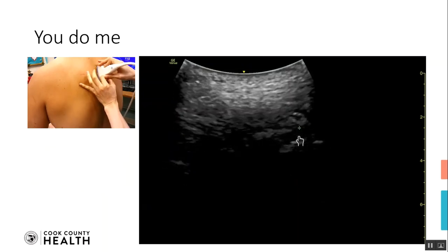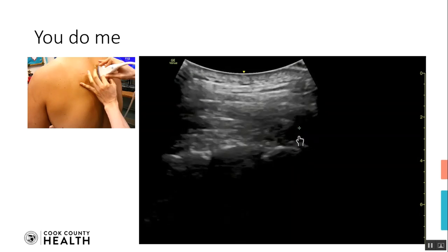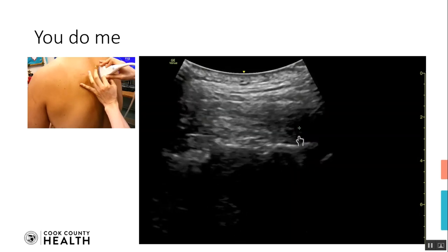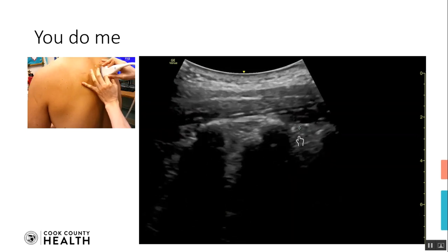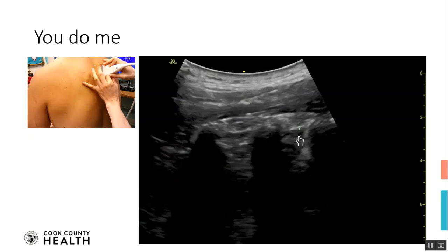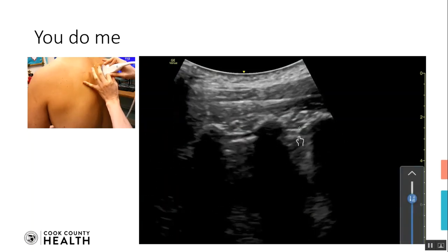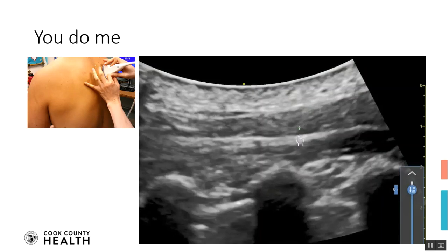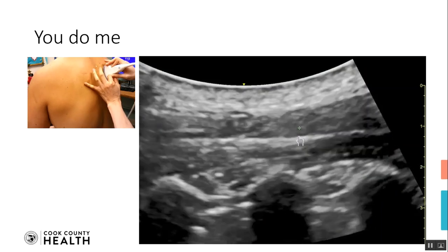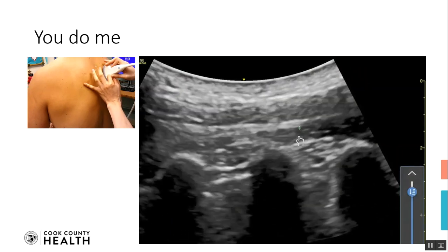When you are disoriented, the best thing that you can do is start finding the ribs. You have to find the rib. If you move laterally, not only can you count the ribs, but you see the ribs that are going to give you the location. Once you have found the ribs, you can adjust your depth to get a better view. You identify the ribs by seeing the curvature of the ribs.